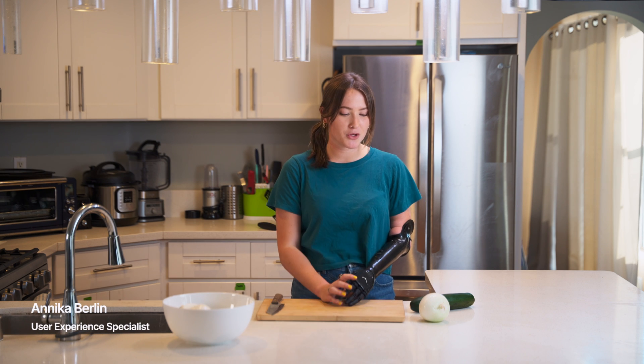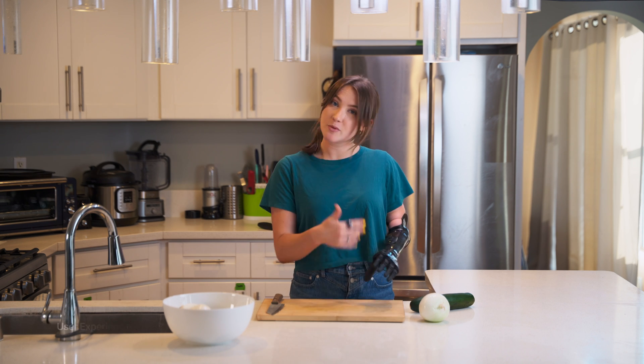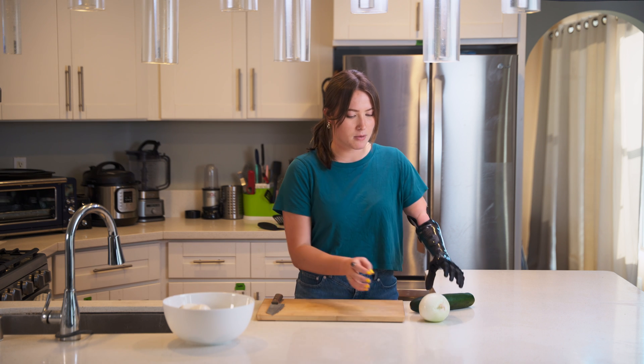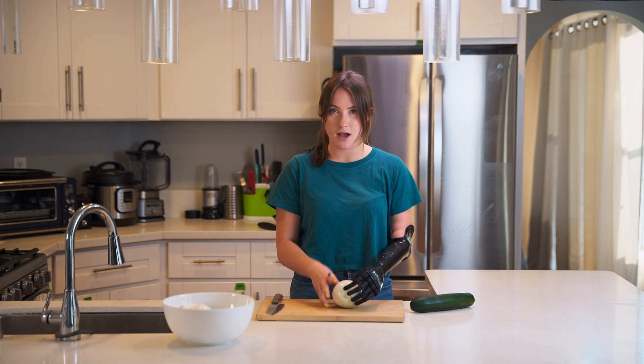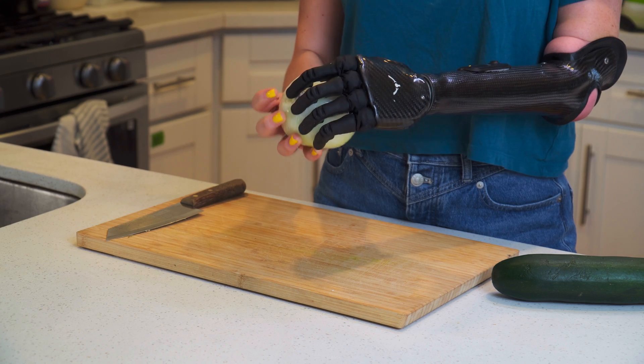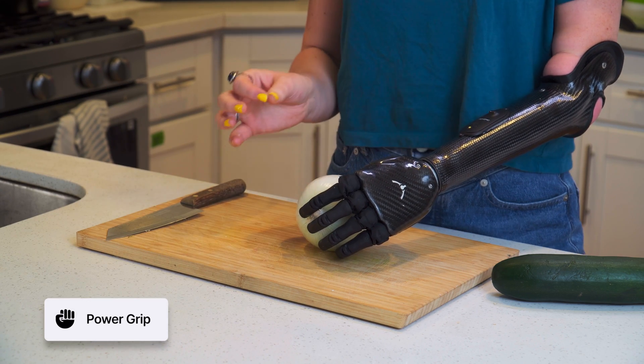Hi, so in this video I'm going to show you how I can cut an onion with my ability hand, or a fruit or vegetable of a similar shape. So to start I'm going to grab the onion and I'm going to grasp it with power grip typically.